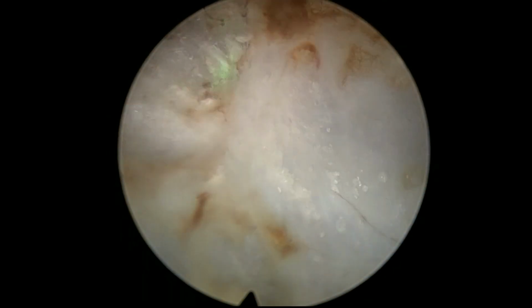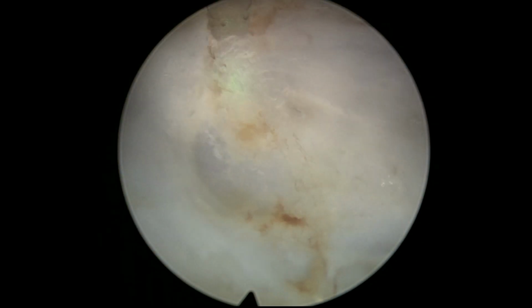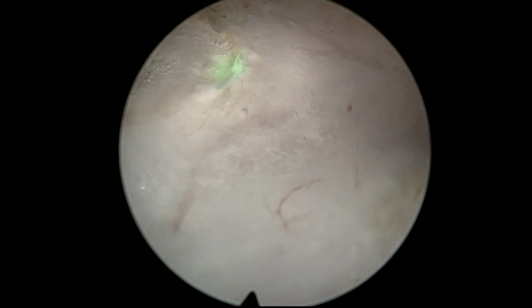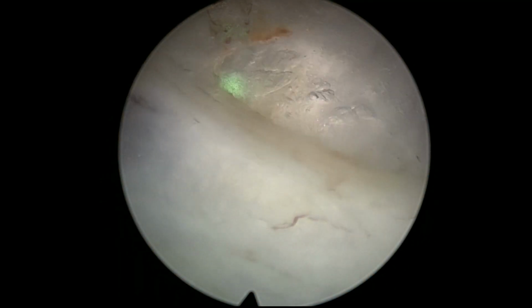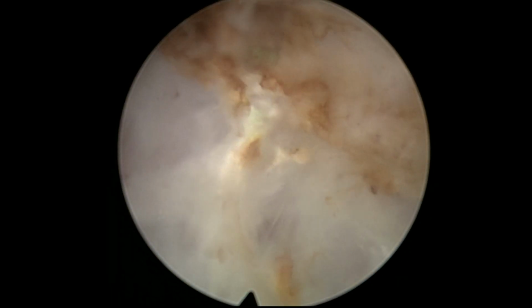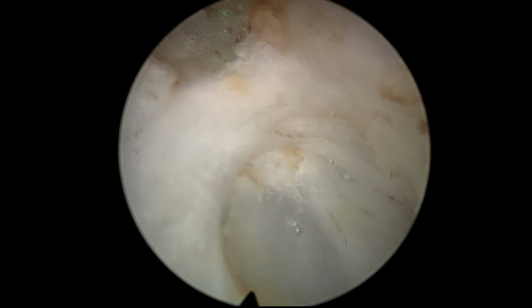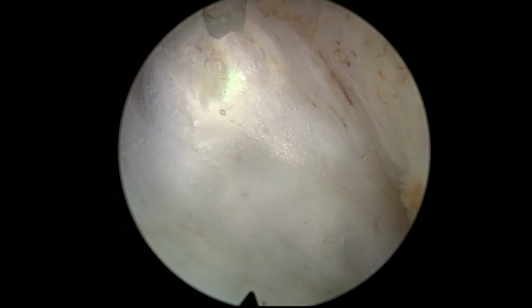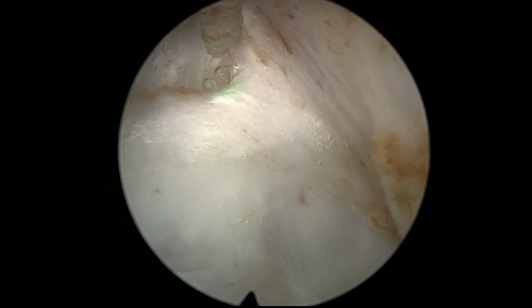But here we are. This is the finalizing moments, as I do with the holmium when I'm negotiating a plane that is turning. I keep my fiber very close to the adenoma, so most of the energy goes to the side of the adenoma and not deepening in the capsule. So the same principles apply. And here we're just finalizing the enucleation. It was not a very large gland, but it is now 18 minutes, 25 seconds, so probably we will finish the case in about 20 minutes, at least the enucleation part.